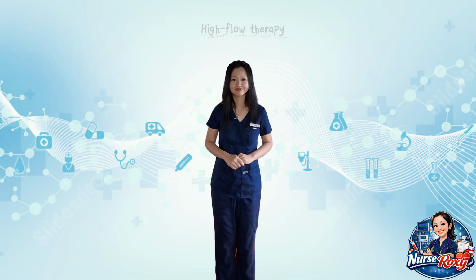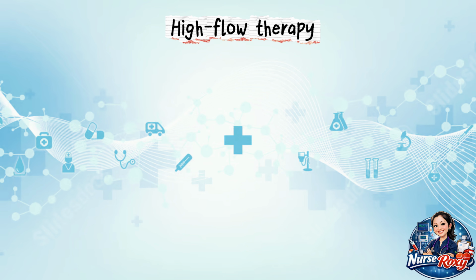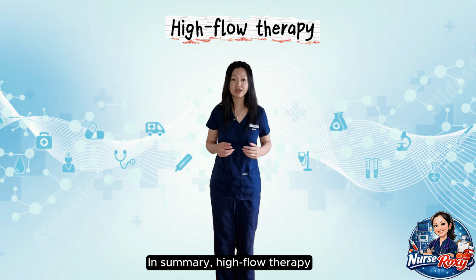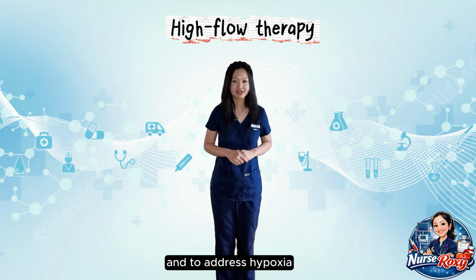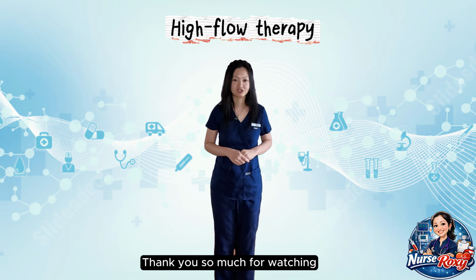We have now reached the end of this video, and I hope it helps you understand when and why we use high flow therapy for our patients. In summary, high flow therapy should be used to maximize patient comfort, to promote sputum clearance, and to address hypoxia or any clinical signs of respiratory distress.